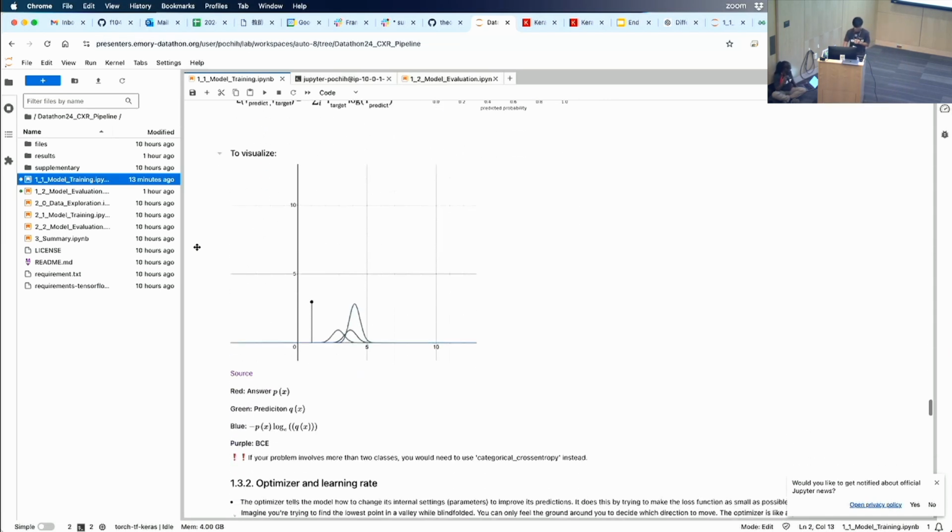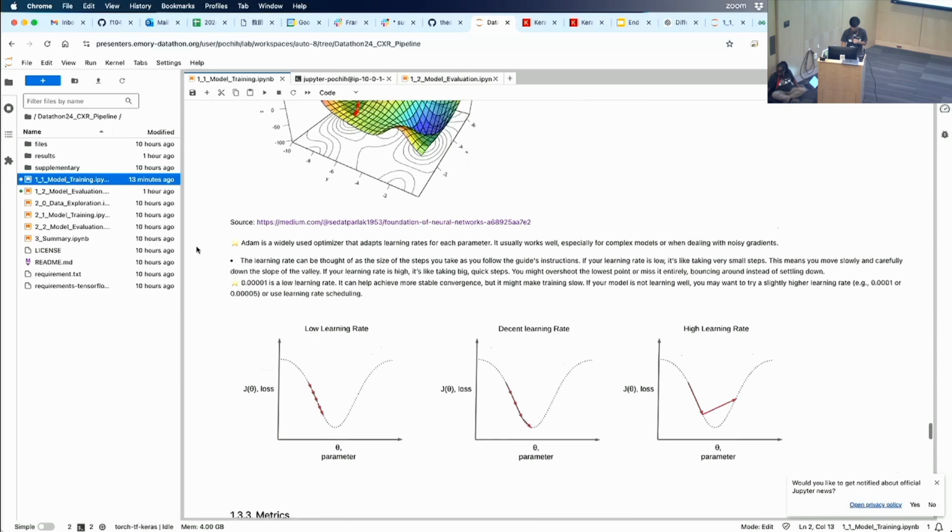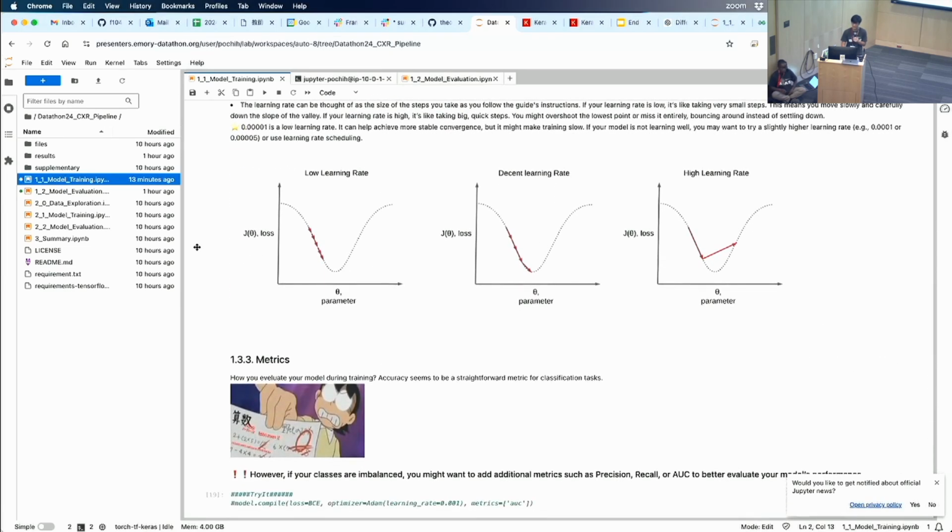Yeah, so the number of epochs has a direct relationship with overfitting. Okay, so if you don't have any strategy to stop early during your training process, then you set your epochs to 1,000, you train it 1,000 times, and it will absolutely lead you to overfitting. Okay, because you over-relied on your training data. So that's another very good practice.